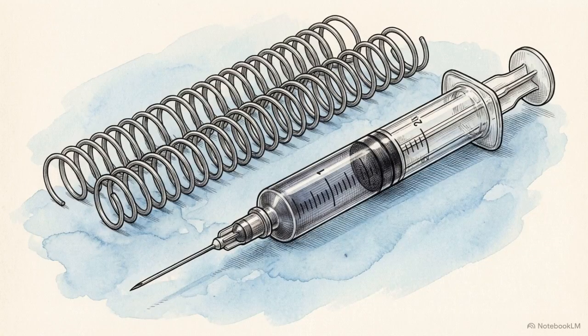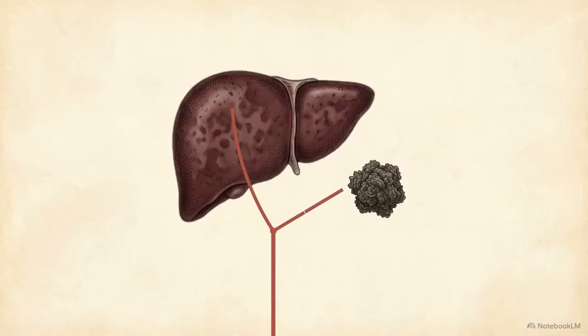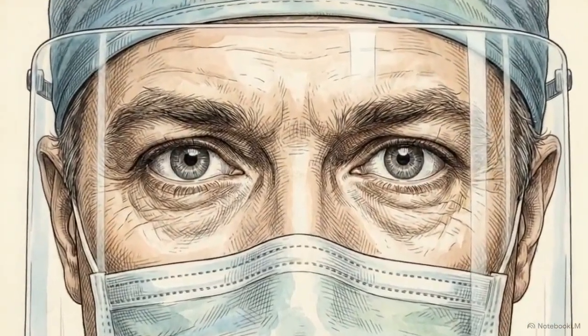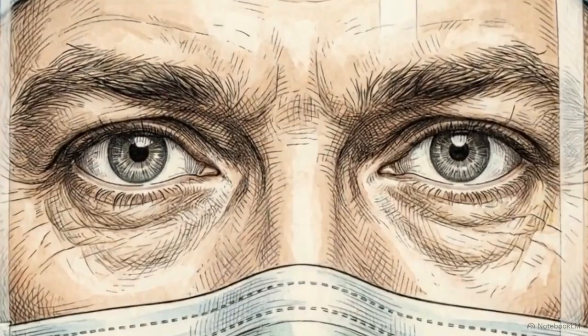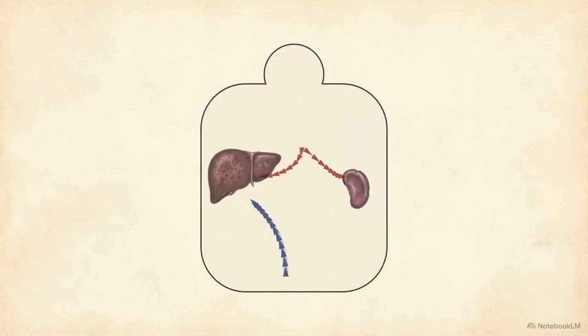Treating the liver and spleen are never isolated acts of arbitrarily deploying coils or injecting radiation. The interventional radiologist actively manipulates fluid pressures. They exploit the specific arterial dependencies of tumors and respect the mechanical limits of collateral flow. The physical architecture of the human body dictates strict rules of engagement. It violently punishes blind guesswork, but rewards precise structural logic. By leveraging the liver's dual supply resilience and actively mitigating the spleen's single-vessel fragility, interventional radiology transforms chaotic internal bleeding and aggressive cancers into controlled, localized cures.